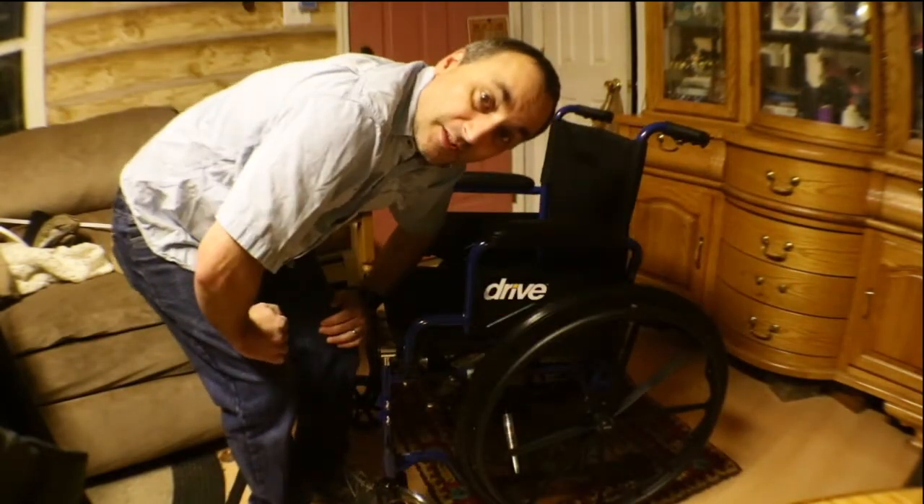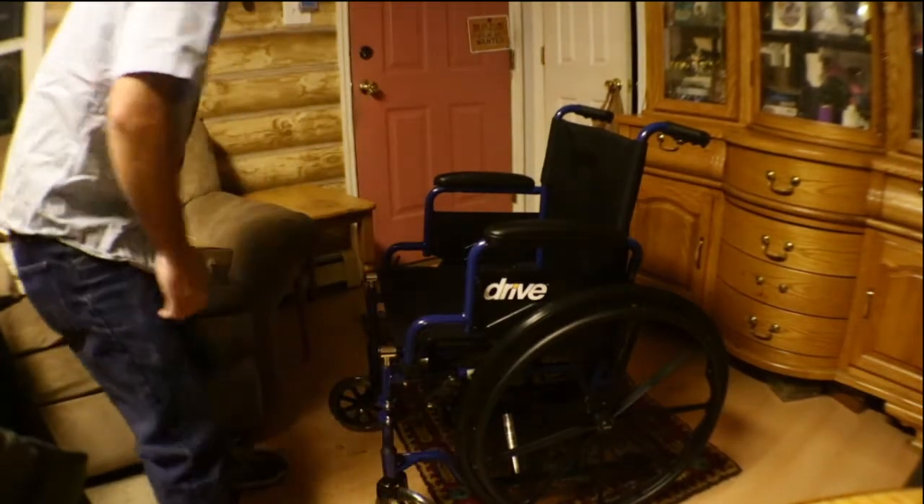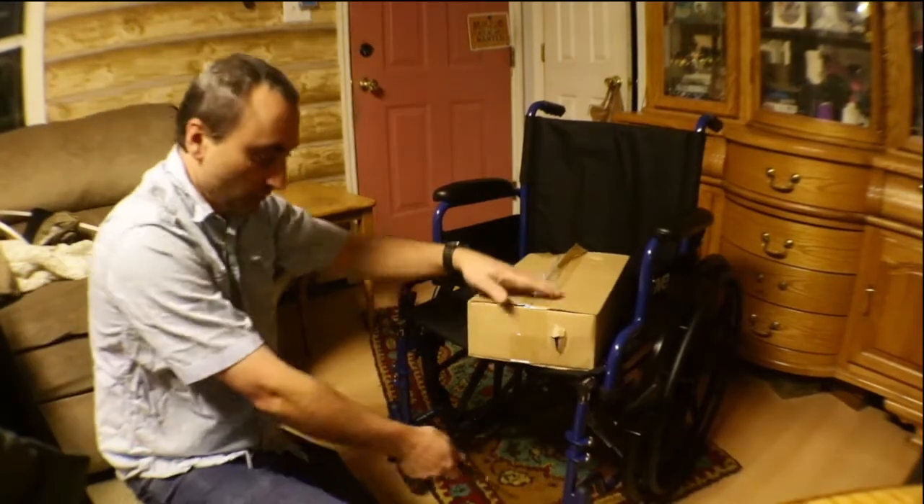This wasn't supposed to be here till Sunday but it's here a day early, so that's fantastic. Speed of shipping gets a thumbs up. And in this box, I'm assuming it's the footrest.